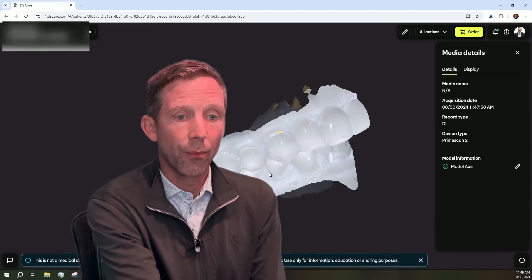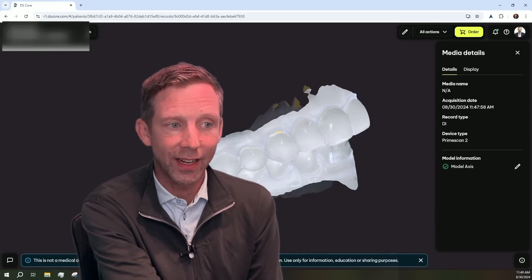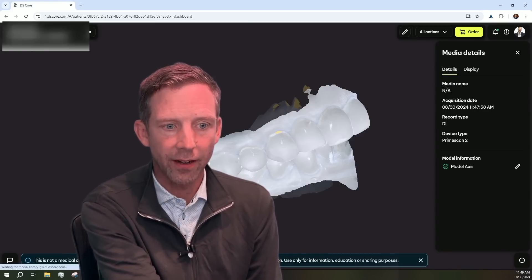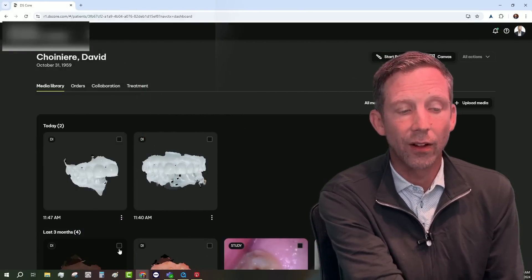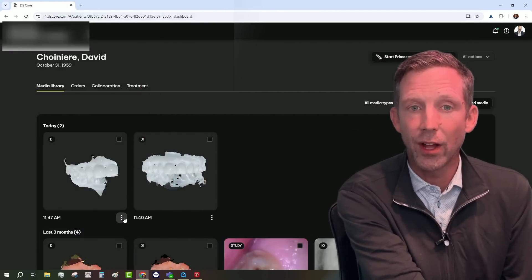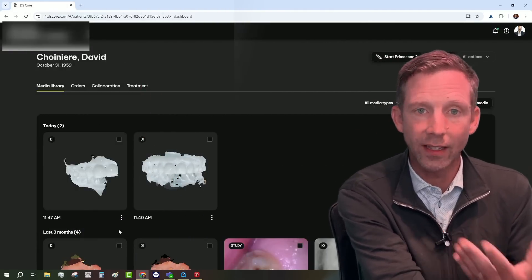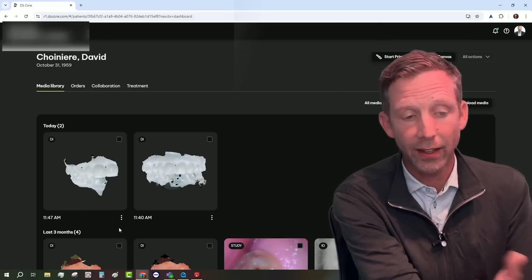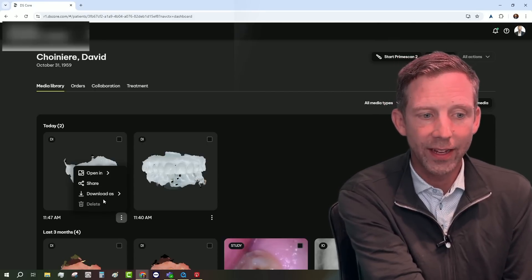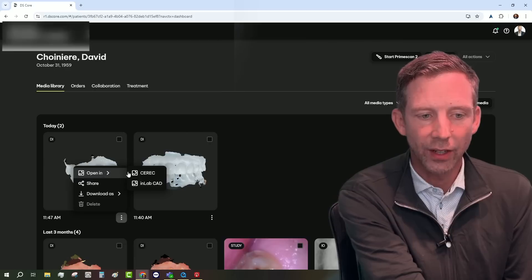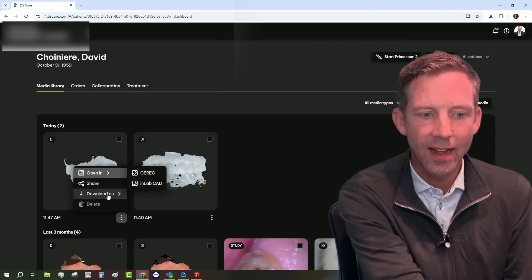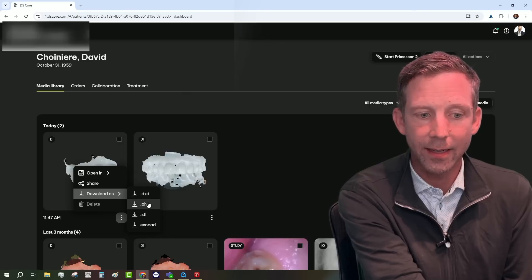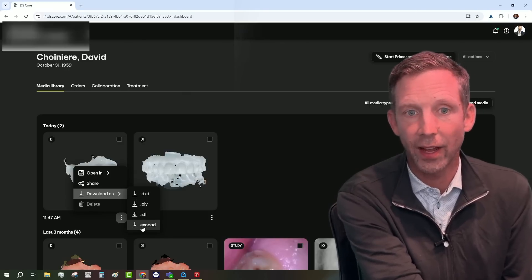Now, if I go back into DS Core, if I just back up here, you're going to see that scan right here. Now, let's say that's a treatment scan, and I wanted to open it up in CEREC, or in Lab, or even ExoCAD. All I have to do is select Open. So I can open it up in CEREC. I can open it up in ExoCAD. I can download it as DXD, PLY, STL, or ExoCAD.